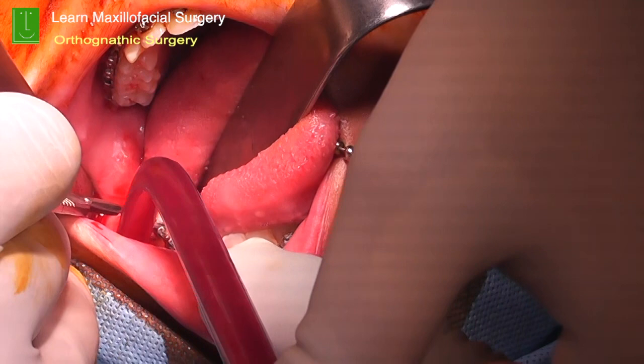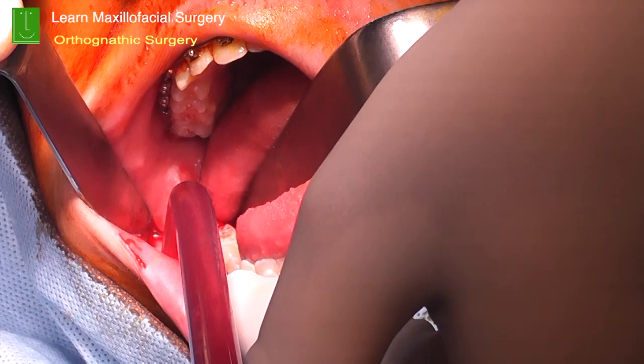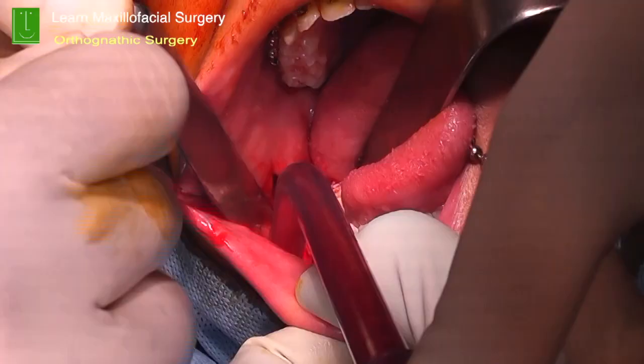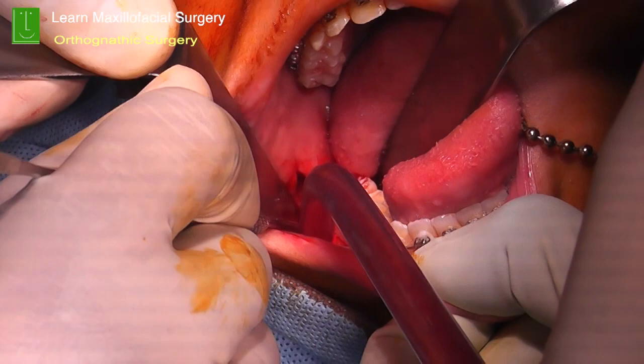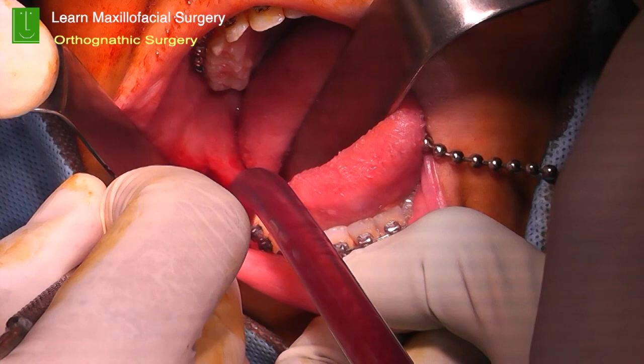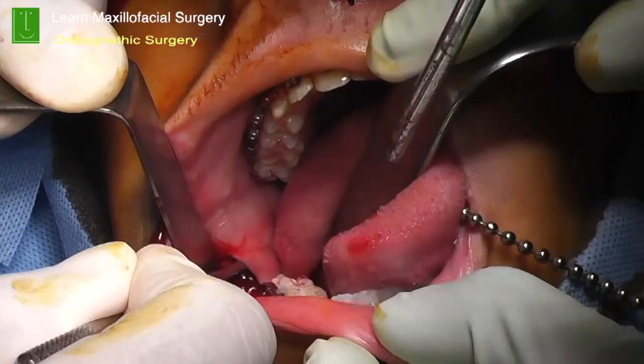The incision is done in the retromolar area. You can say it's a kind of a modification of a larger incision which we use routinely for the wisdom teeth. The distal incision is taken more buccally. That's very, very important. You go from the wisdom tooth area, just behind the 7. If the 8 is already removed, or if it is buried inside, then from the distal aspect of 7, you take it to the anterior border of the ramus of the mandible. And then you progress along the vestibular incision and then give a vertical relieving incision, usually up to the second premolar area.